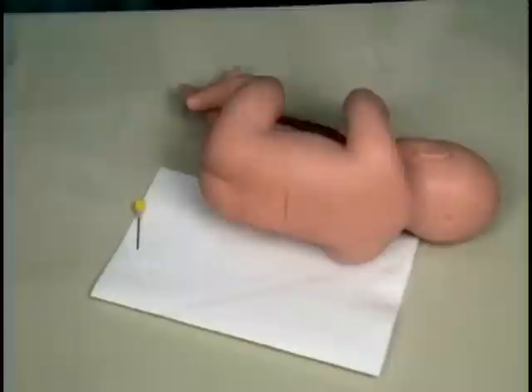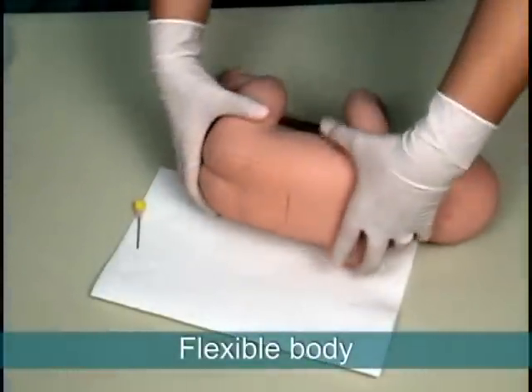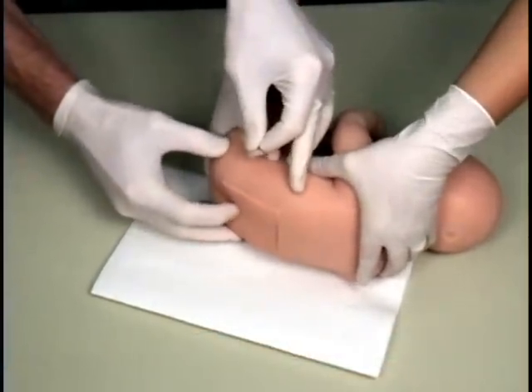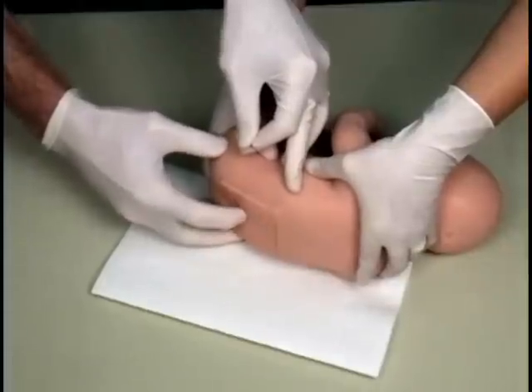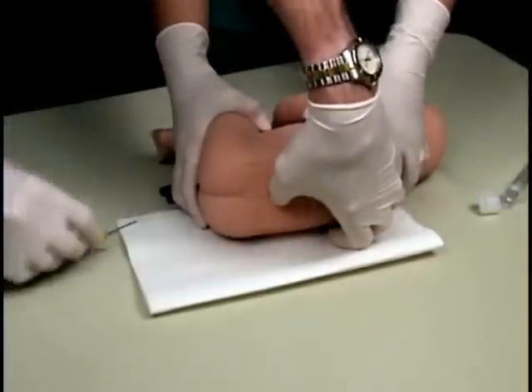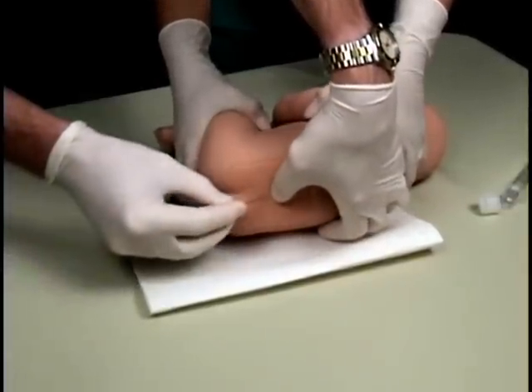Lumbar Puncture Baby's flexible body allows users to simulate the process of articulating the vertebrae and moving the interspinous process from a neutral to an open position. When using the blind technique, the trainer's landmarks can be palpated, including the spinous process.